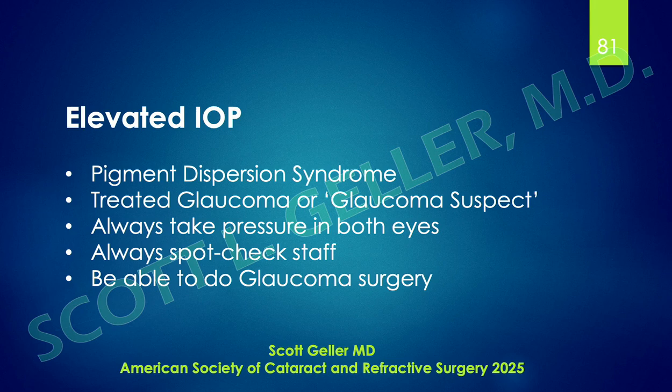Well, I can understand that. You get busy with your injections, you did your thing, you think it's like a capsulotomy, and it's like, well, no problem here. Come back in a couple of weeks. The patient did call on the telephone and spoke with staff and says, everything looks gray. And the staff said, well, you just had an eye procedure. Of course, everything's going to look a little blurred.